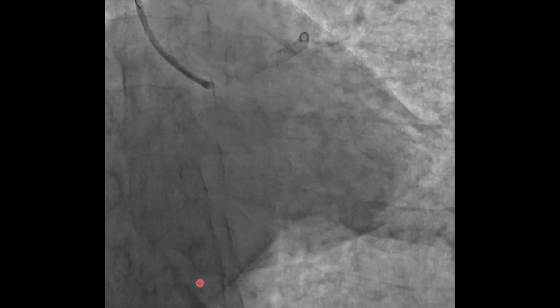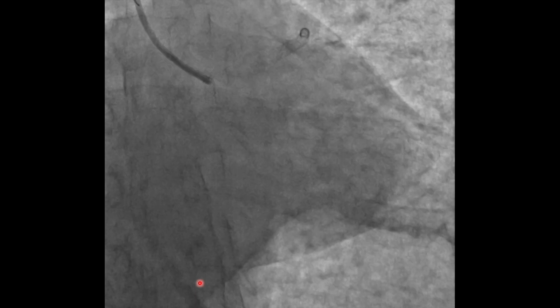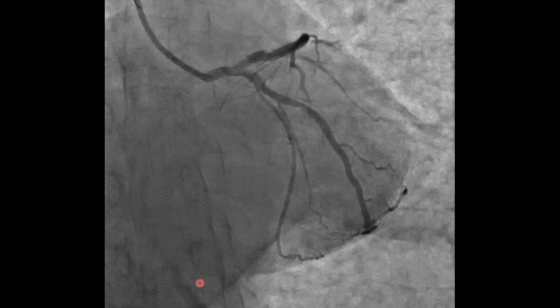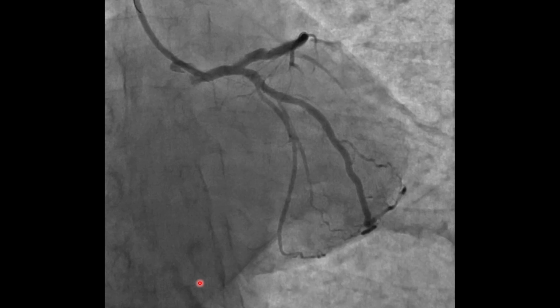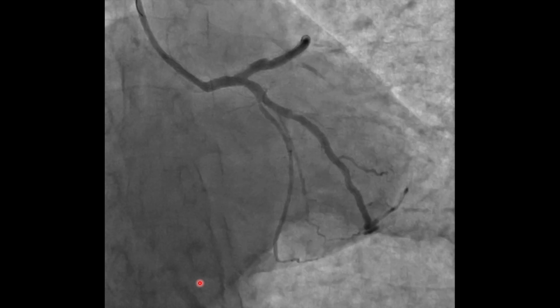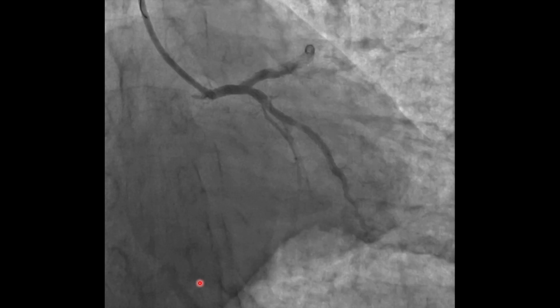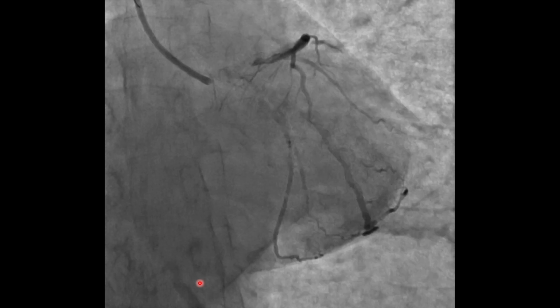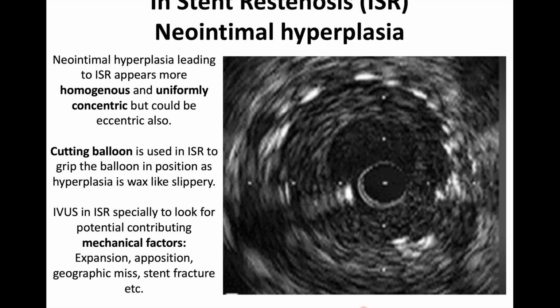So you don't try to touch it against the wall, because that way you will fracture your stent. You can't take it all the way to the 5.5 millimeters. So the 4 millimeter stent, we just went across the aneurysm. I'm sorry that I lost the final result clip for this, so I don't have the stenting image available. But we did it from the ostium, going across the aneurysm or the ectasia.